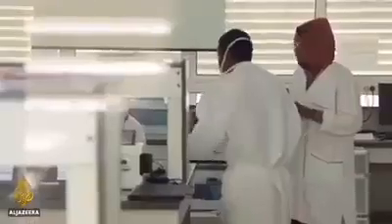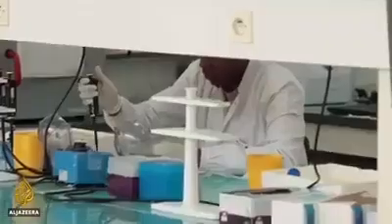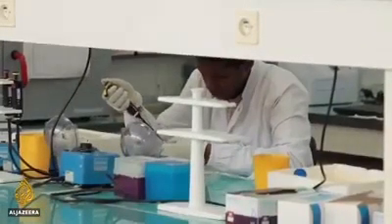It has no shortage of testing kits thanks to this lab at the Institut Pasteur. Researchers are developing a $1 quick diagnostic kit, originally made to test for dengue fever. Patients drop blood or saliva onto the devices and wait for a bloodline to appear, like a pregnancy test, explains researcher Amadou Sall. There is no need for a highly equipped lab. It's a simple test that can be done anywhere.